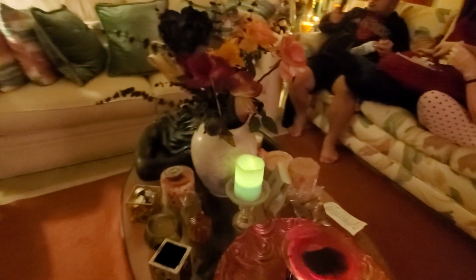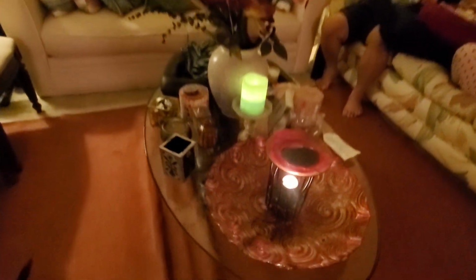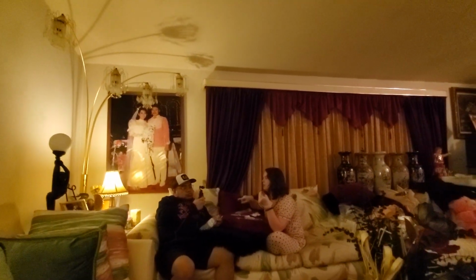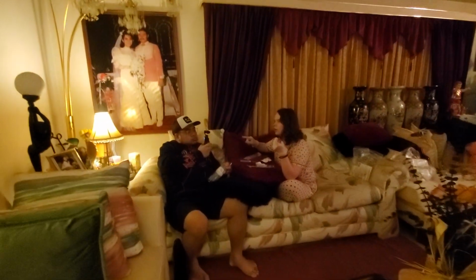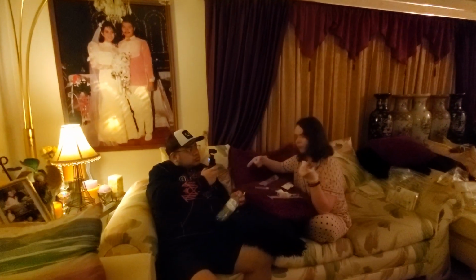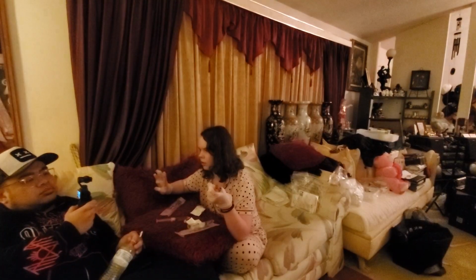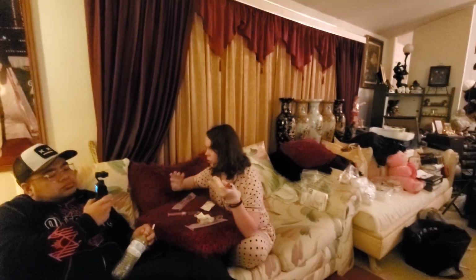Okay, so I've drawn my blood. I'm going to put my labels on my tubes in the specimen bag and zip it up. I'm going to do my post-assessment. The only thing that I'm rechecking is the placement of the tube. So I see that the CVAD hasn't moved. So I'm good on that note.